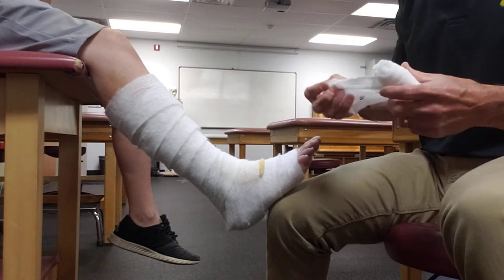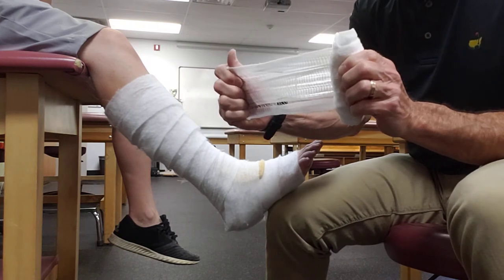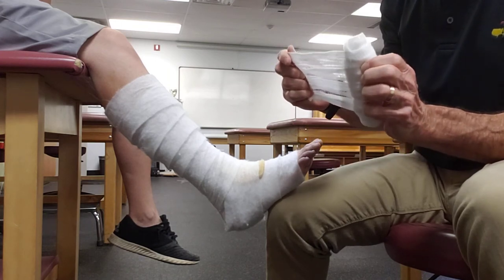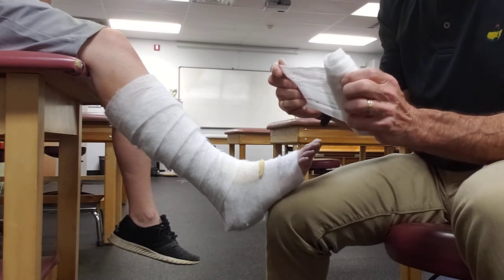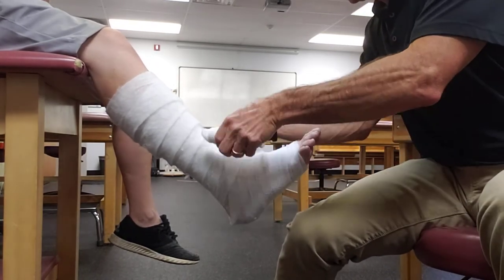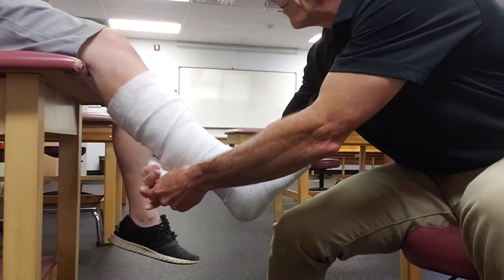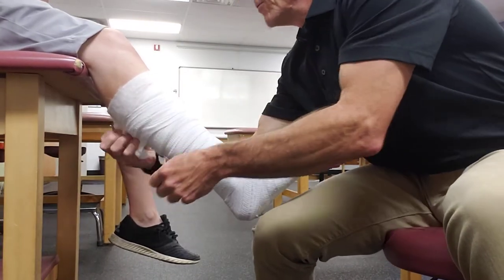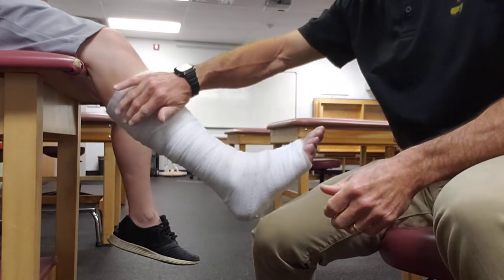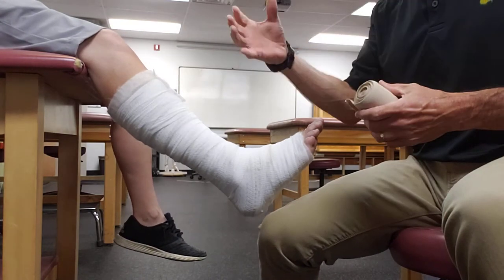The second layer is called cling — basically gauze, except it has a little bit of stretch to it. Cling is a brand name; conforming bandage is the other name. This is the layer that some multi-layer compression dressing packages will omit. It's not really adding compression — it's literally meant to smooth out and compact down the padding layer already on the leg. It can just be spiraled as well. The padding layer is designed to absorb a lot of exudate, which is important since venous insufficiency patients drain a lot.